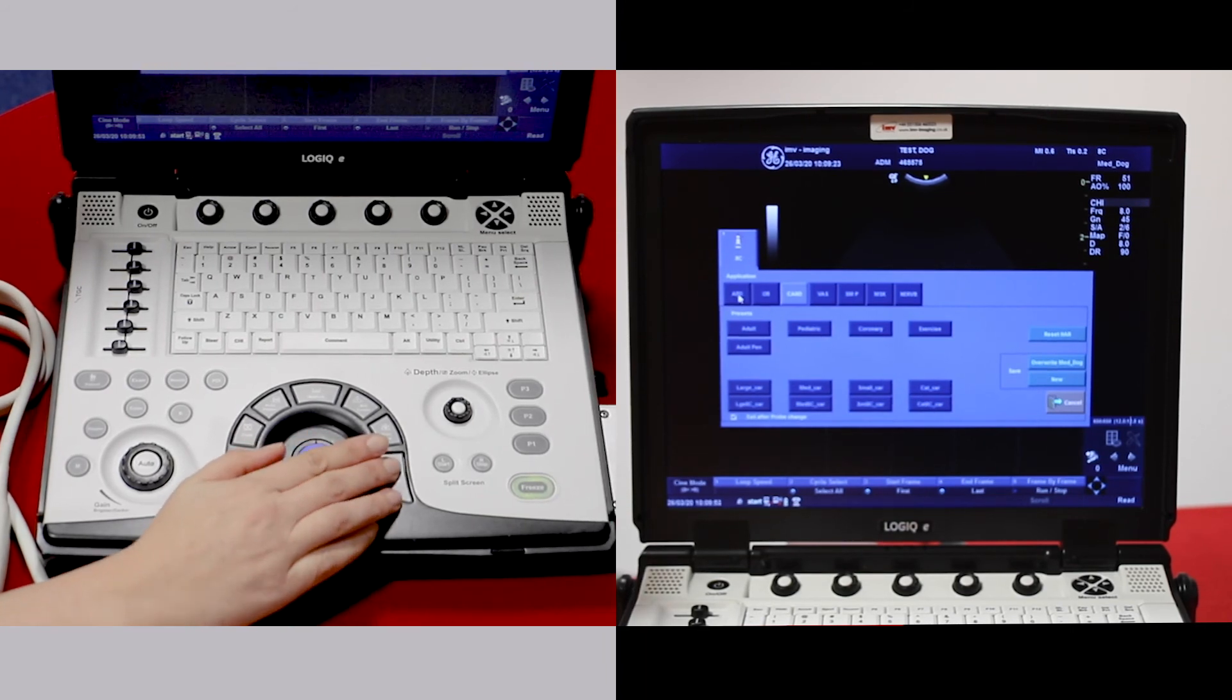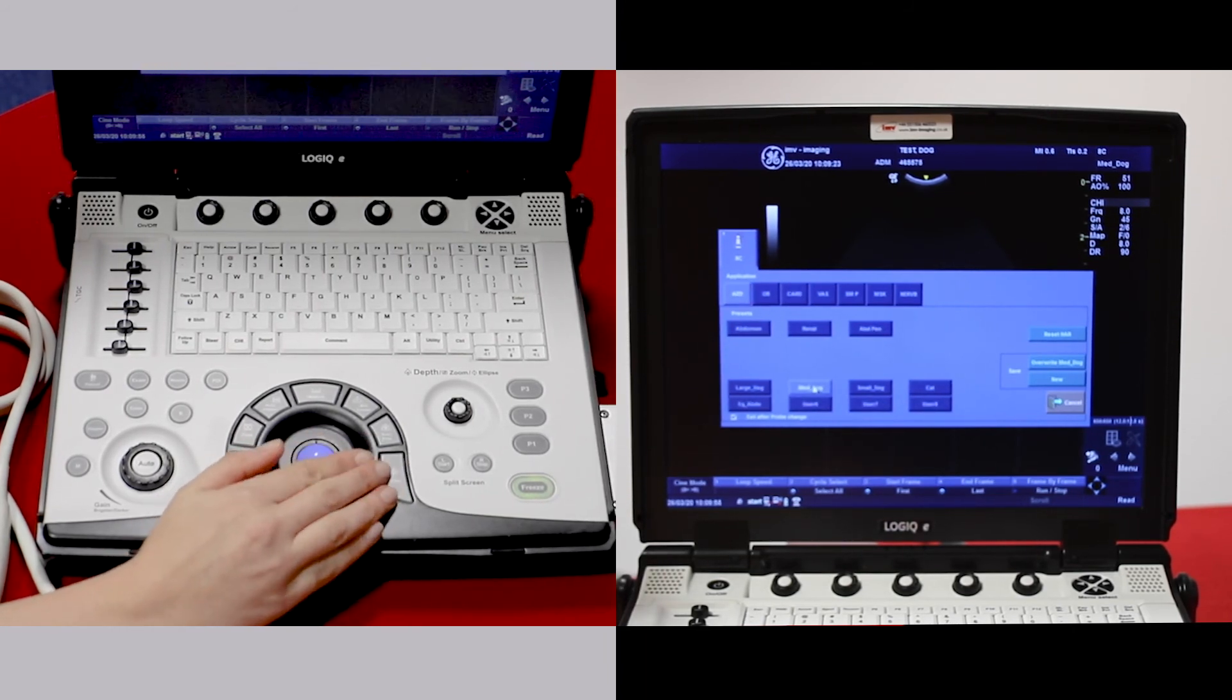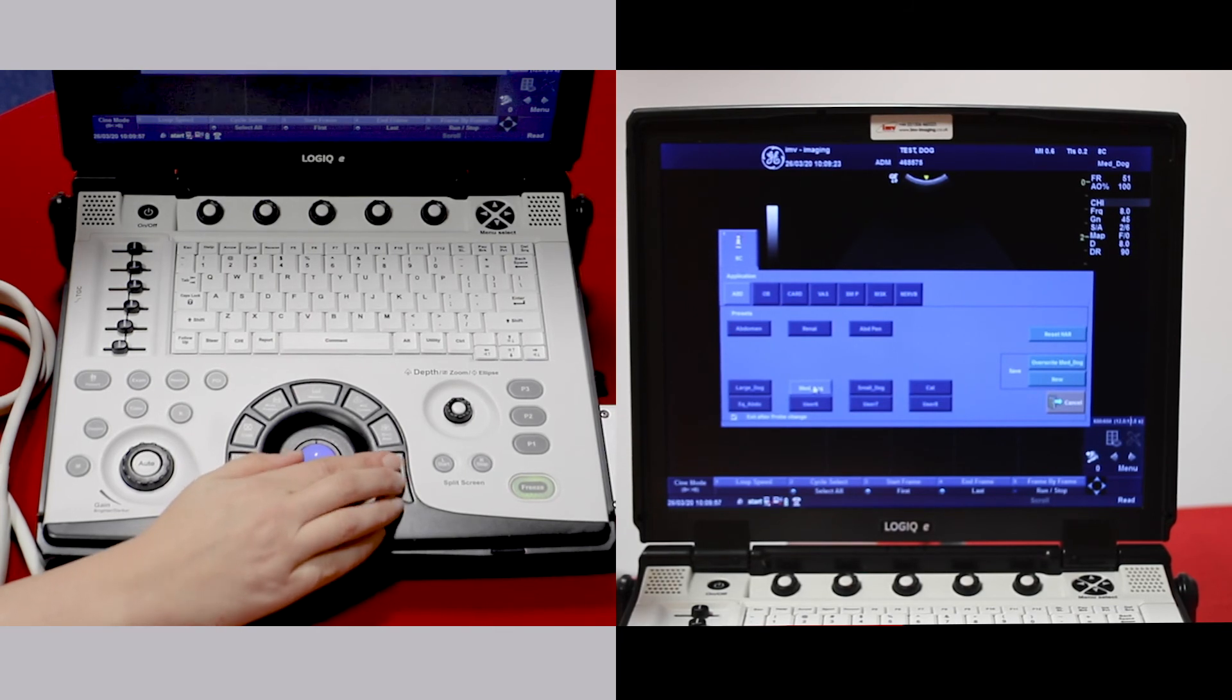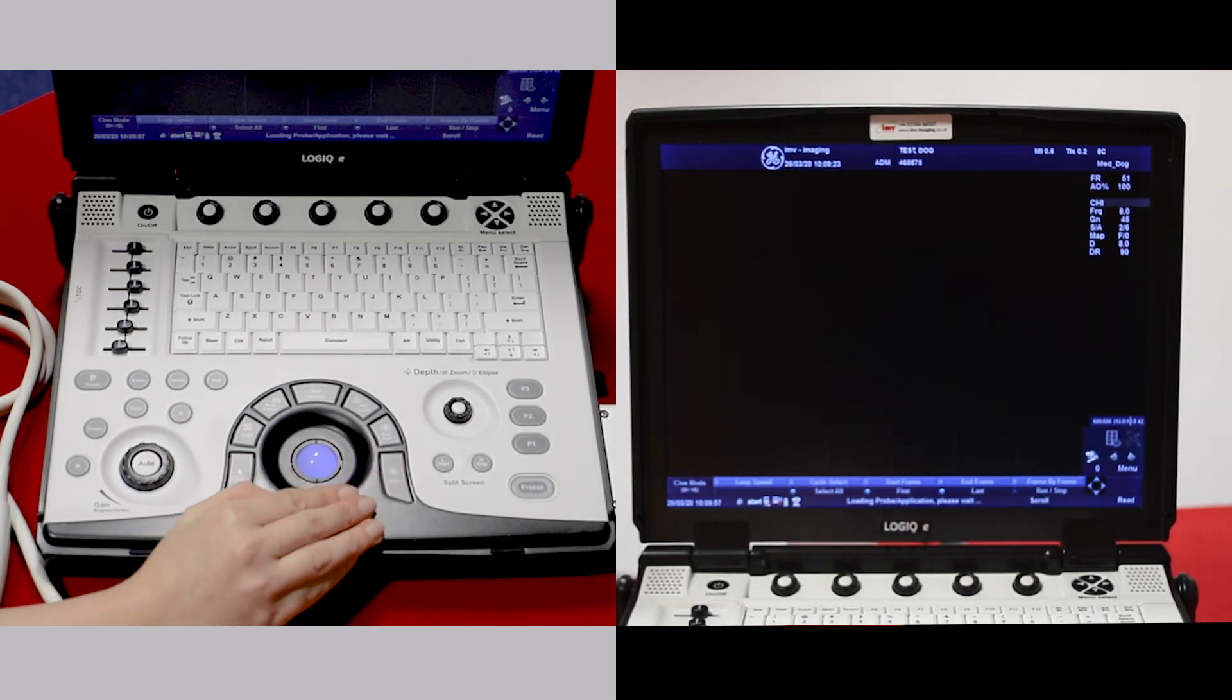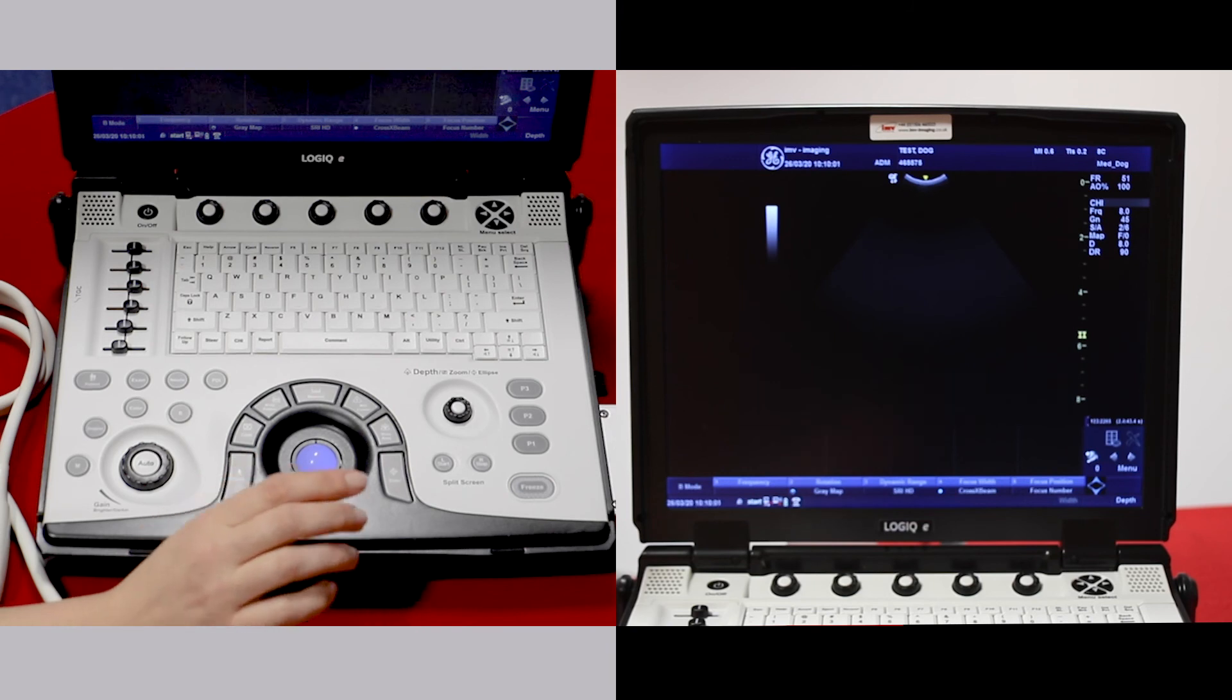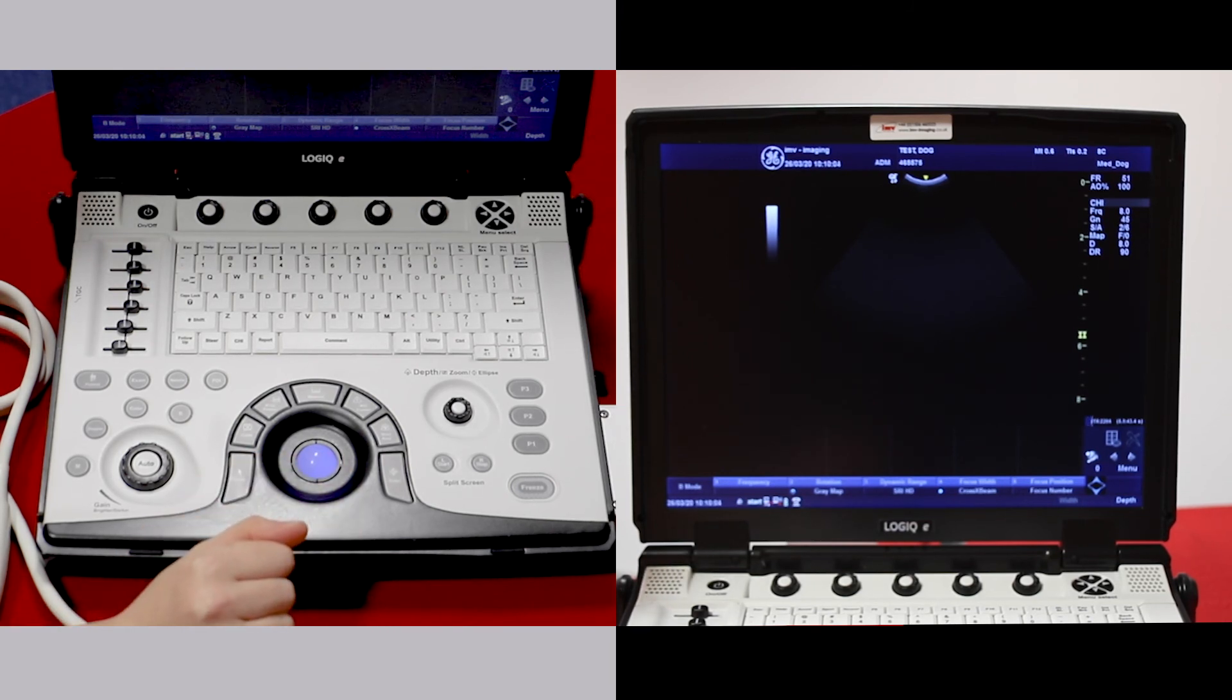If I go back into abdomen and pick medium dog setting, we've set the machine up so that you will have to do very limited amount of changes to get a good image.